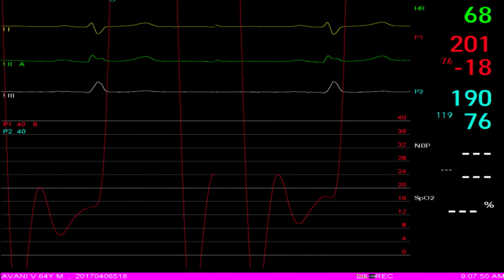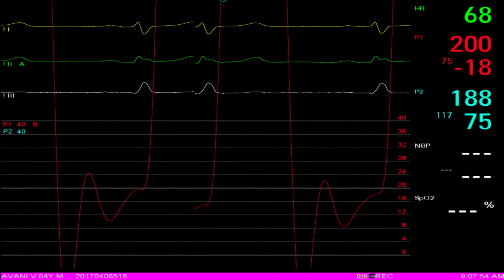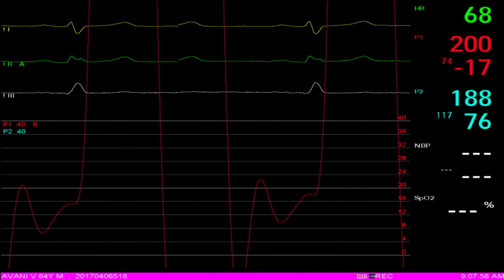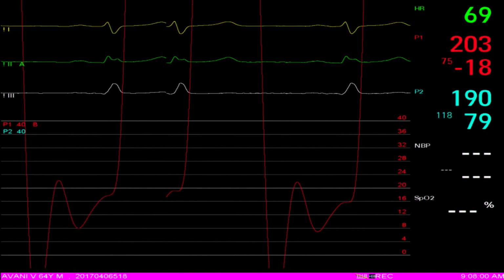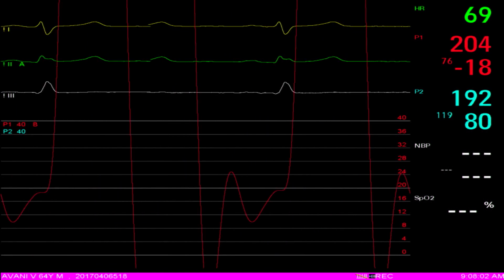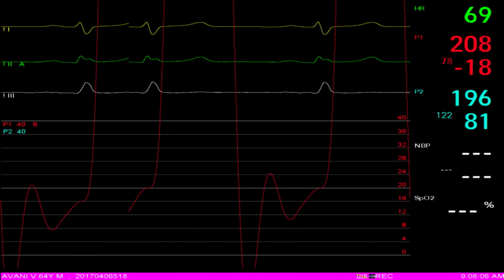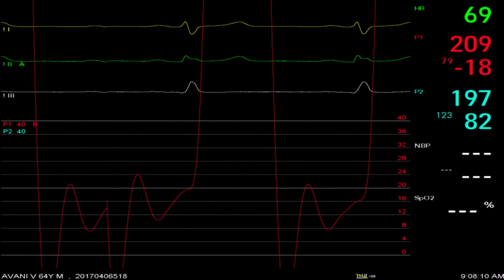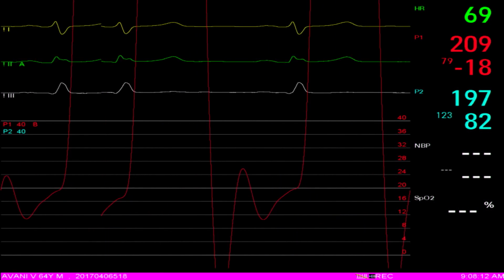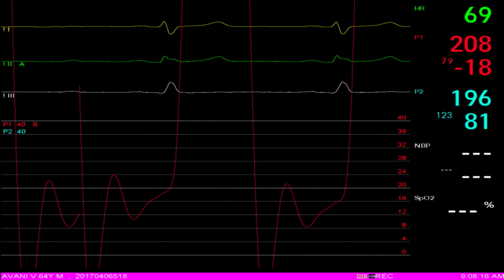If it touches 20, then what I do is give intravenous furosemide to find out whether we have given a lot of fluids. Right now it is somewhere around 18. The baseline in this patient, Dr. Raghu measured as somewhere around 16. Yes, sir. So from 16 it has gone up to 18. It's not too alarming. I think I'll be able to manage this patient with medications.